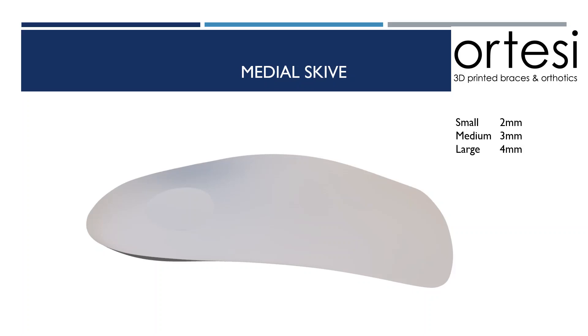When considering what size of scyve to choose, it's important to take into consideration the size of the foot. For example, on a women's size 5, a 2mm heel scyve might be adequate, whereas on a men's size 14 foot, a 2mm heel scyve might be undercorrected.